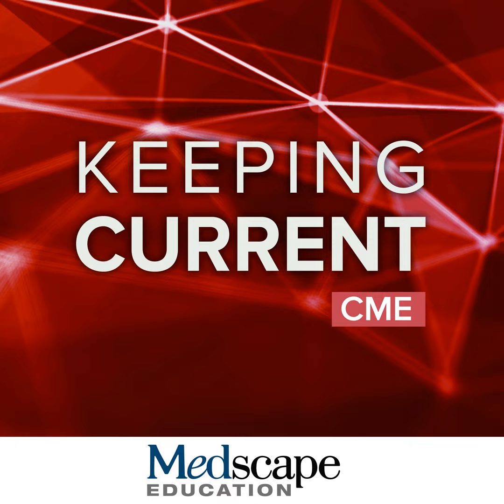And this is the same case that I showed you before, but with gadaxetate, you can see we have nice arterial phase hyperenhancement, we have washout, and now you can see that the contrast between the background parenchyma and the lesion is becoming really prominent by the time we get to transitional hepatobiliary phase.